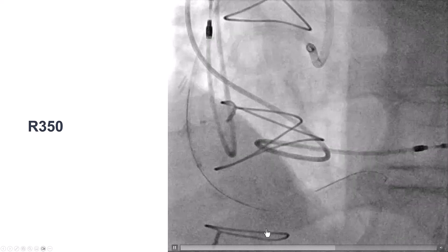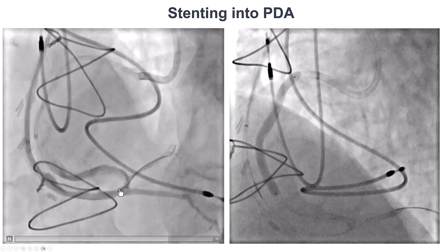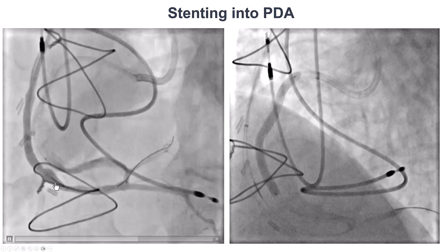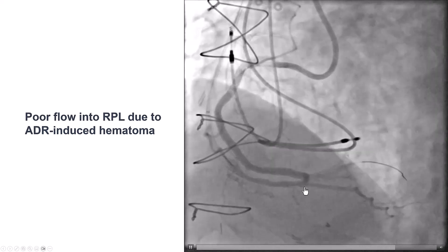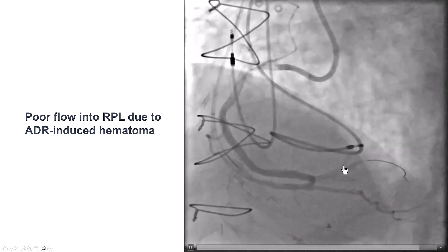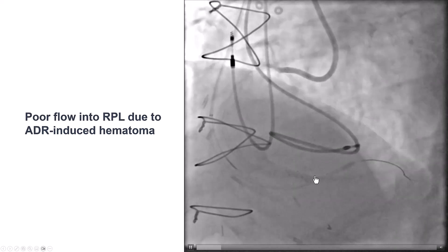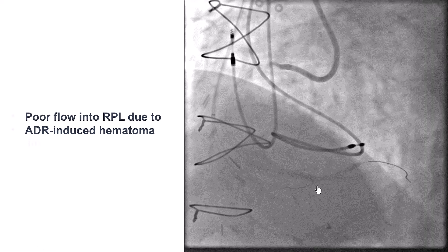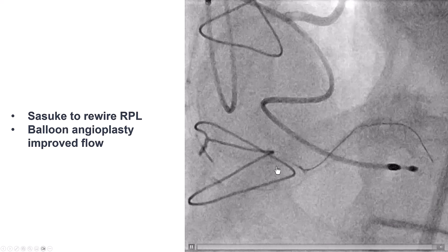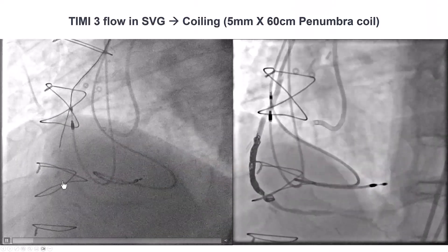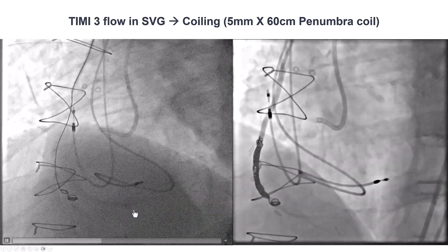We externalized an R350 guide wire and pre-dilated. We decided to stent all the way into the PDA, jailing the posterior lateral, but maintained a guide wire from the vein graft into the posterior lateral for safety. After stenting into the proximal RCA, we had good flow into the PDA but poor flow into the right posterior lateral — likely because the antegrade knuckle wire had advanced too far, creating a hematoma compromising the lumen. We used the Sasuke to advance another guide wire into the right posterior lateral and performed balloon angioplasty, including a cutting balloon to drain the hematoma, which improved flow into the posterior lateral.